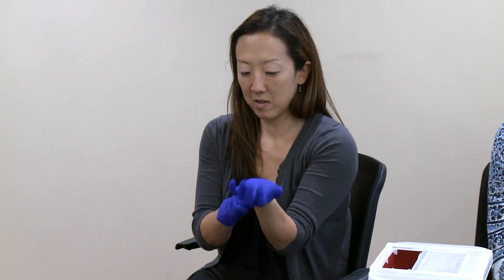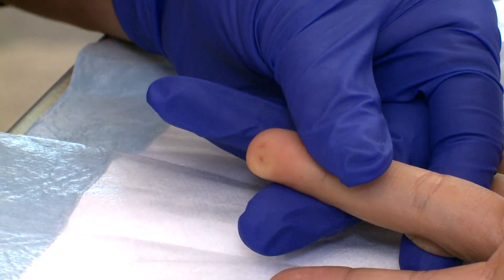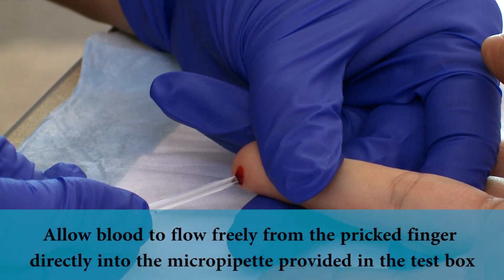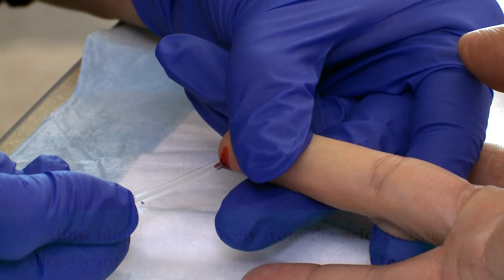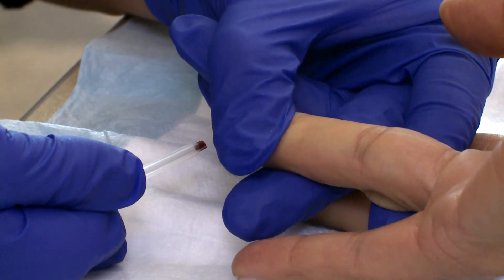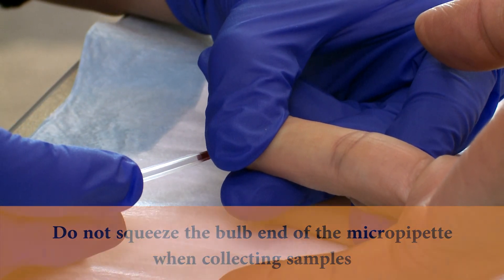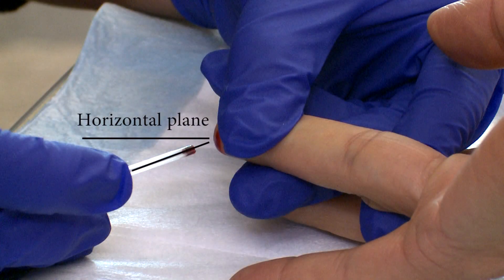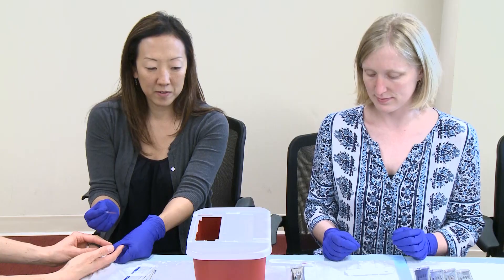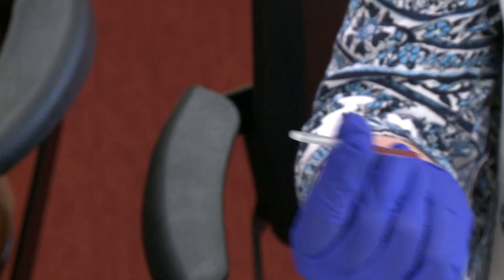Wearing clean disposable gloves, the blood collector should clean the finger to be pricked with alcohol, allow the finger to air dry, and use a disposable lancet to collect blood into the provided micropipette. The used lancet should be placed in an appropriate sharps waste container. Allow blood to flow freely from the pricked finger directly into the micropipette provided in the test kit. The micropipette uses capillary action and will fill automatically. Do not place the tip of the micropipette directly on the finger, or there will not be sufficient airflow for the capillary action to work. Do not squeeze the bulb end of the micropipette when collecting samples. Hold the micropipette slightly below the horizontal plane and allow it to fill completely to the marked line. Avoid getting air bubbles in the micropipette. The completely filled micropipette should carefully be passed to the team member responsible for performing the FTS. Care should be taken to hold the filled micropipette horizontally to avoid spillage.